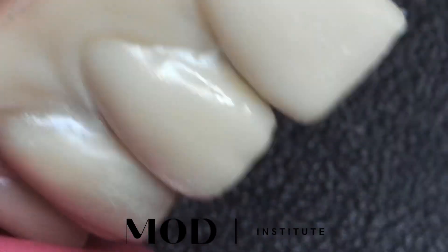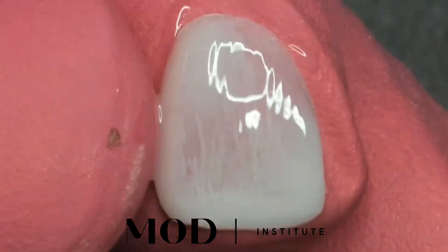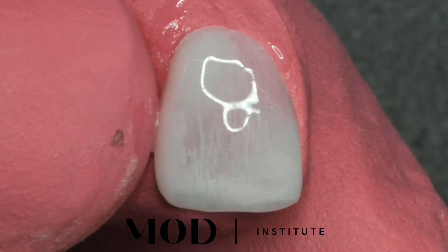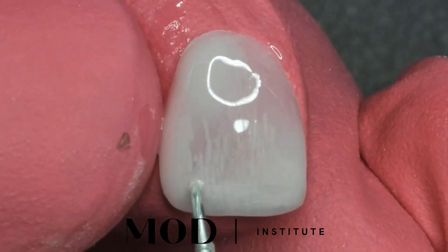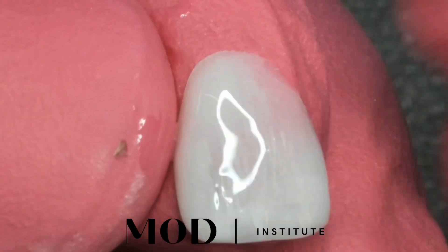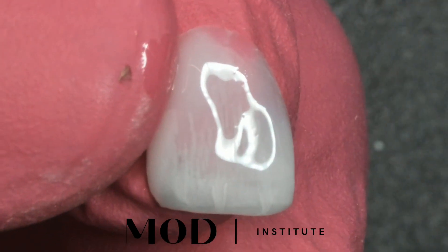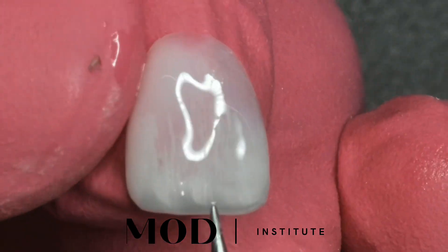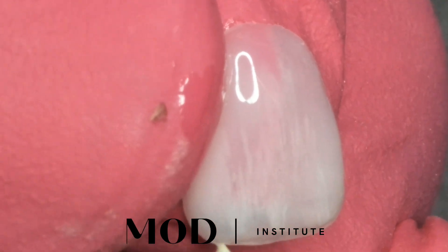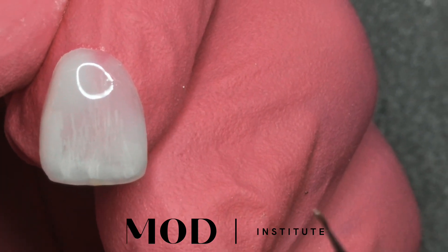From here we're just going to go ahead and finish it up just like we normally would. You could use the candy coating technique that we teach at the Mod Institute, which is ultra easy. Essentially you're going to put an ultra thin coat of native resin on top of the veneer. Once glazes get better we could use glaze in these scenarios, but currently all the glazes are honestly kind of terrible out there. So we're going to interdiffuse colors and tints into that liquid resin layer — typically mamelons, a little bit of translucency, a little halo here or there, whatever your heart desires. The key is interdiffusing it down into that liquid resin so it's protected.